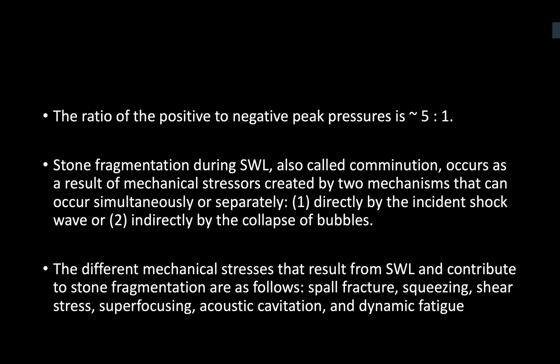And the second process is cavitation, where plasma bubbles coalesce at the stone surface. And when a shockwave passes through them, the bubbles will then expand and collapse and release microjets of energy which are directed against the stone surface.